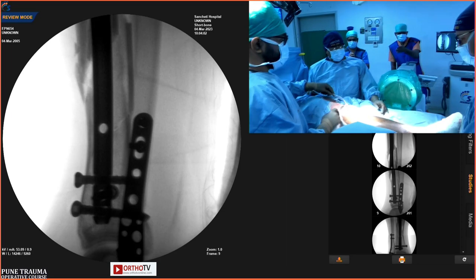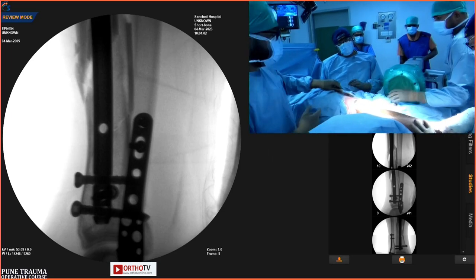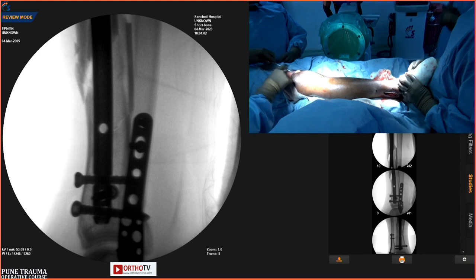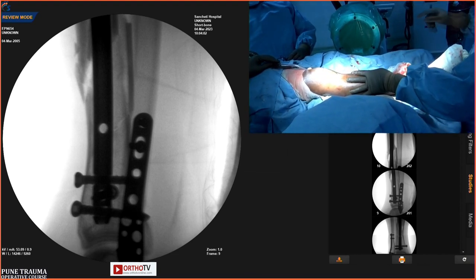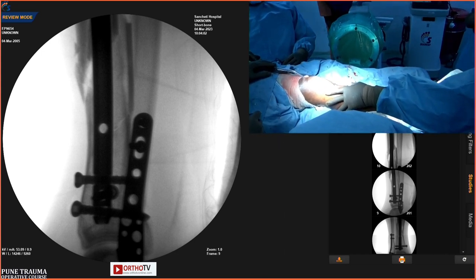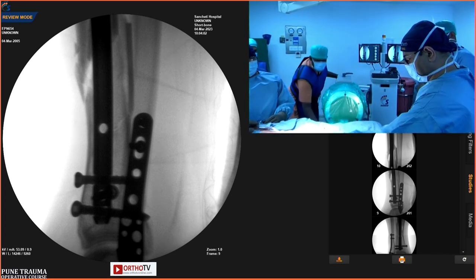Sangeet has a question. Sir, one doubt. Yes, please. Sir, the last screw: how to get a correct trajectory for drilling the last screw? You never get a perfect round, even if you rotate by 30 to 40 degrees. And often you end up drilling the opposite cortex or the opposite side of the nail. No, that is not true. That is not true, see, Sangeet.